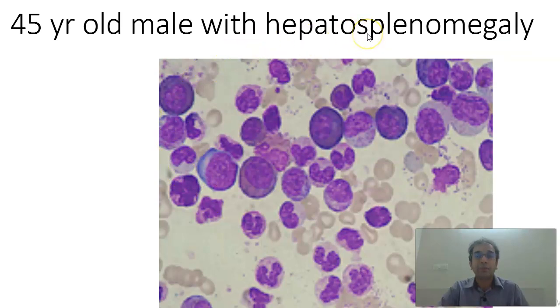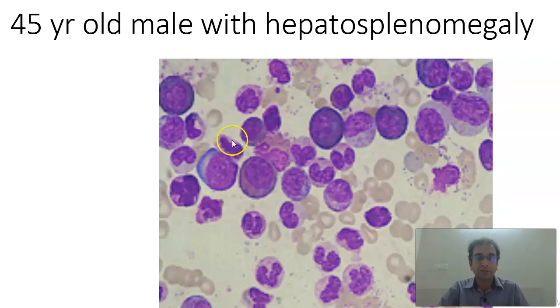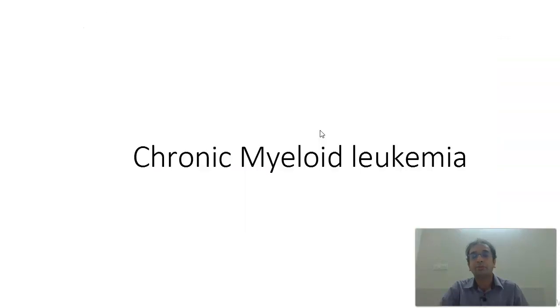Next, a 45-year-old male with hepatosplenomegaly. What you find here are a multitude of cells — neutrophils, band forms, myelocytes, metamyelocytes (indentation less than half), and blasts. I am also looking for eosinophils and basophils; one or two of those would make me comfortable calling it chronic myeloid leukemia. For CML, you will have to do translocation 9;22 — the Philadelphia chromosome is positive.